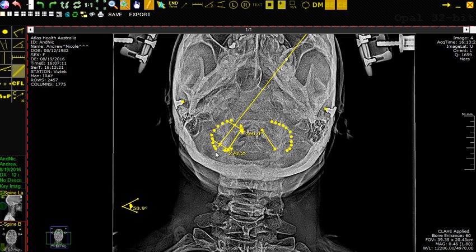So this is what we've created. If this is the shape of a person's atlas, we've basically created a line which goes straight down the middle of the long axis. And so if there's any slipping of that joint, if we take an x-ray at this angle, we're going to be able to see it. It should be normal, but then we can see if it's slipped over or slipped under, and that lets us know exactly where we need to direct our course of care.